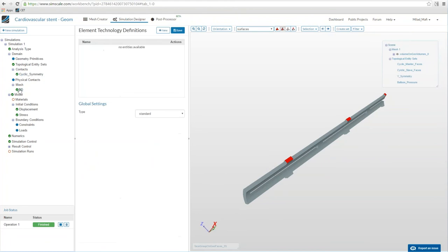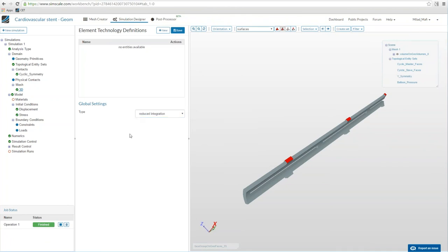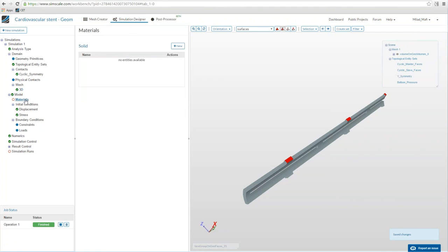We assign the cyclic symmetry contact to the master and slave face sets and save. Next, we switch to the mesh item and under the 3D sub-item we add element technology definitions. We change global settings from 'standard' to 'reduced integration.' This helps achieve good results for second order meshes — whenever you use a second order mesh, I would recommend using reduced integration instead of the standard setting. Click save and everything is applied. Now we just need to define boundary conditions and the material.